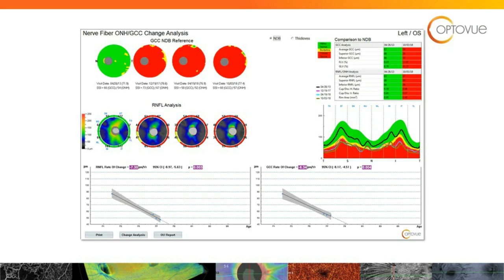Okay, next question. Do you only have one case for angiogram showing less perfusion? Yes. So far, there are many, many cases, but for this particular talk tonight, we just have one example. However, I'm gathering many more examples, and so I hope in the near future to be able to show dozens of examples like I just showed. But I'm starting to come up now on third and fourth scans because of how long I've used the angio. So I'm just starting to hit that sweet spot in looking at the scans as time goes by.